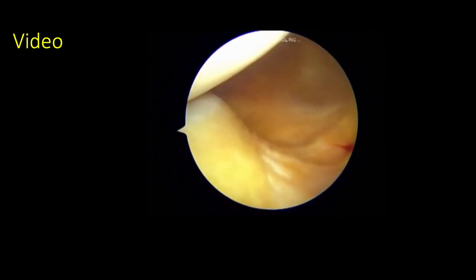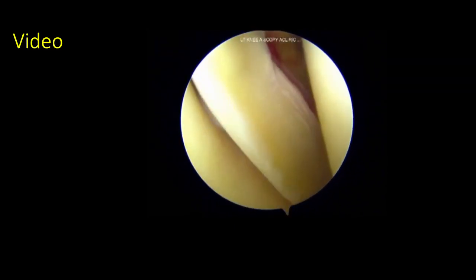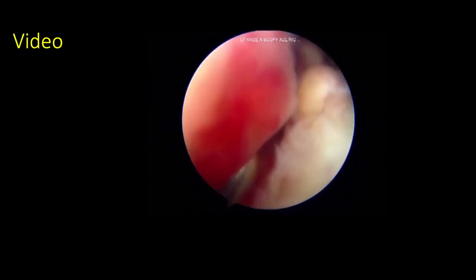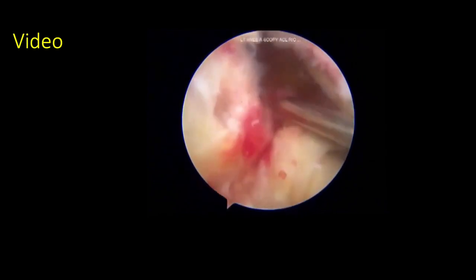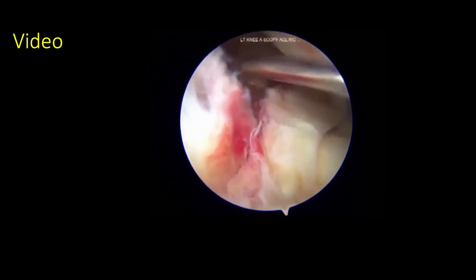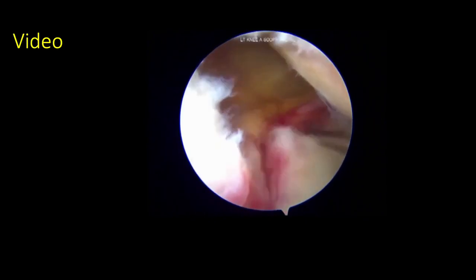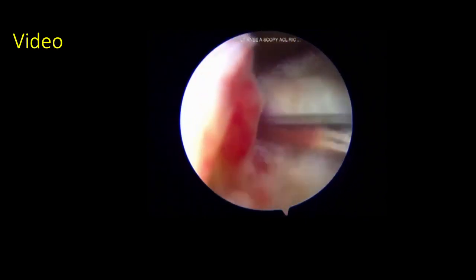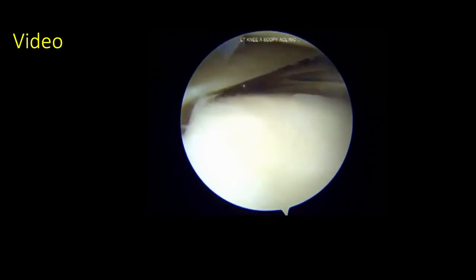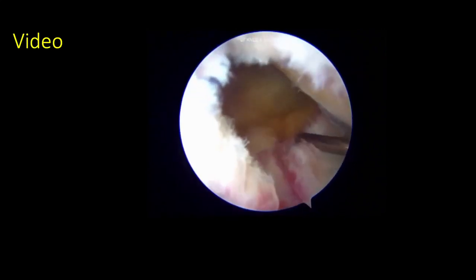The repair technique includes a diagnostic arthroscopy with standard portals in the supine position to identify the presence of ACL injury, ramp lesion, and the ZIP lesion. Once the ZIP lesion has been confirmed, the scope is switched to the anteromedial port and a probe is passed from the anterolateral port with the knee in figure-of-4 position. The extent of the ZIP lesion is examined by probing the completeness of the tear, and a meniscal rasp is passed to enhance biology for healing.